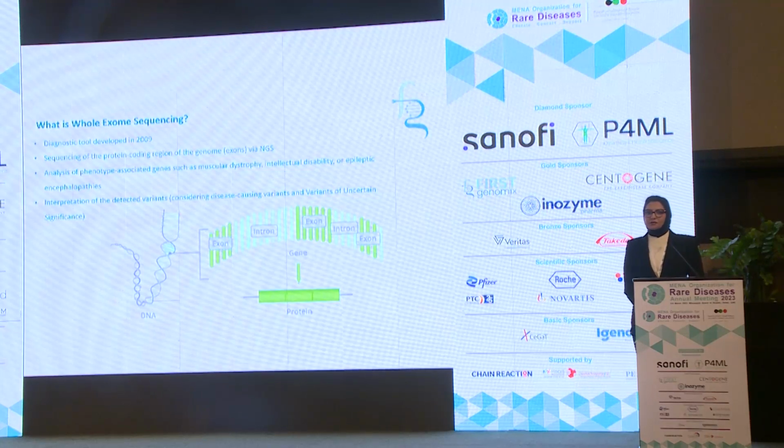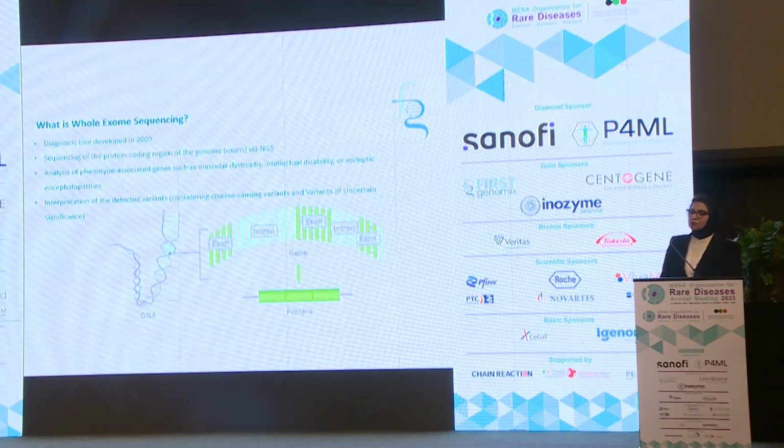The quality of the diagnosis depends on two different parts. The first part is the sequencing, so you have to ensure that you're using the correct capture or sequencing kit, first of all. And then the most important part is the analysis itself. The analysis is one of the most important factors in the quality of the results. And in our lab, we focus and invest more in that part because we believe it can take us to a different level of diagnosis.